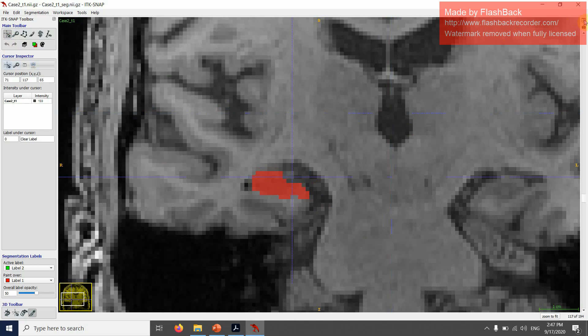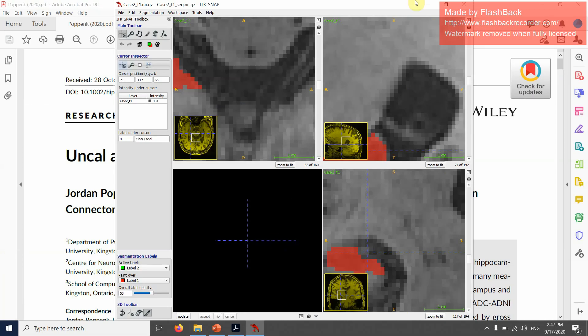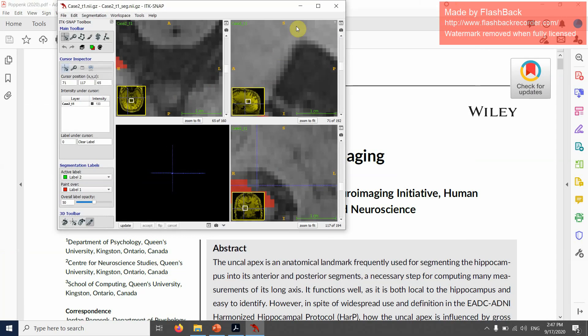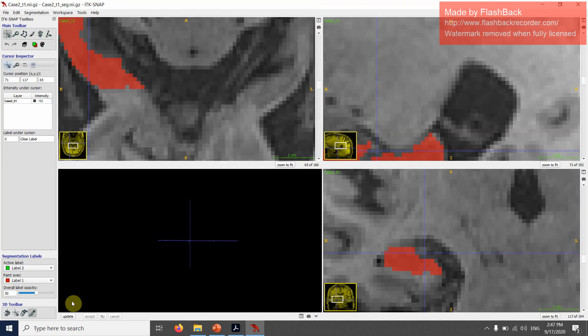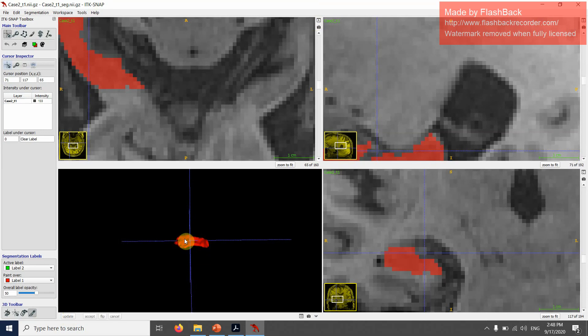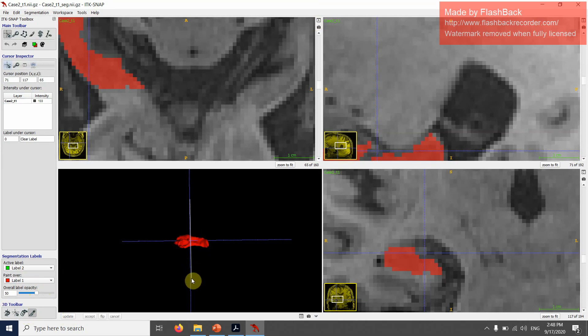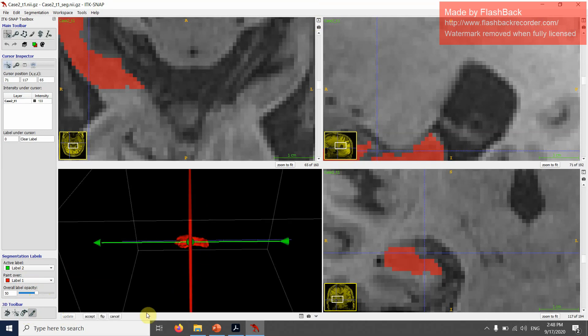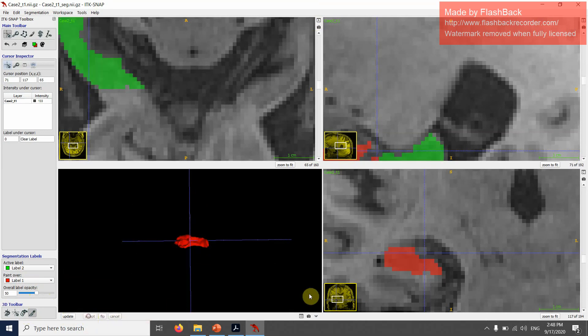I'm going to do the same thing in the 3D panel. Again, trying to align these two lines. I'm going to draw a line on top of that and then flip it, accept.